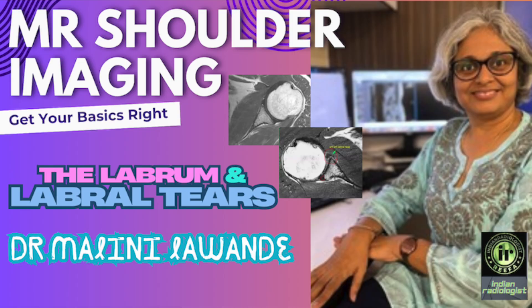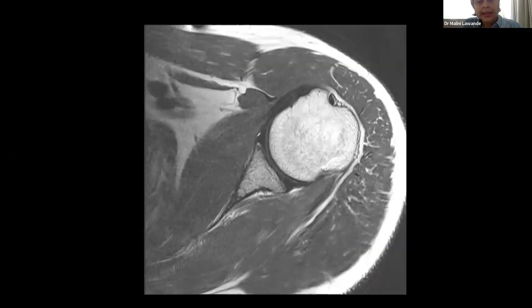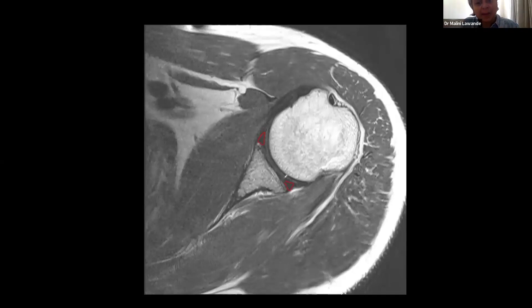A quick recap on how the labrum looks: the labrum is seen as triangular, well-marginated, hypointense structures because they are fibrocartilage. They are dark on all sequences and should be sharply marginated, as seen with the anterior and posterior labrum.